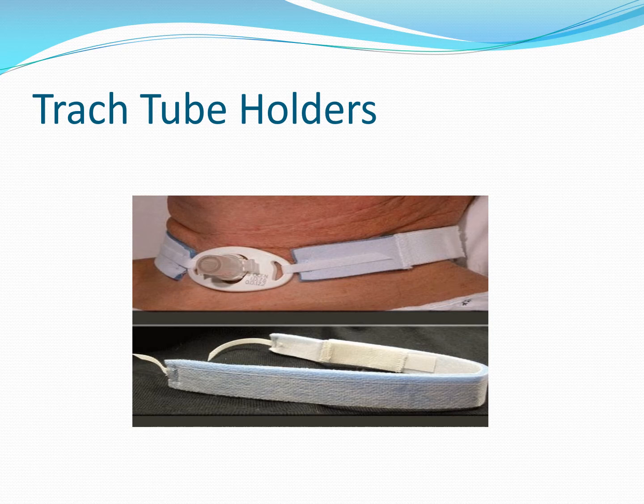There's also a variety of commercially available trach tube holders. This particular one depicted in this picture looks to be the Dale, D-A-L-E, model. I'm not promoting one versus the other, but this has some very nice features. It has a Velcro that you can adjust both at the flange itself and further around the neck to ensure that it's not too loose or too tight.